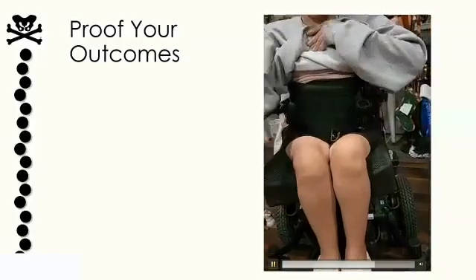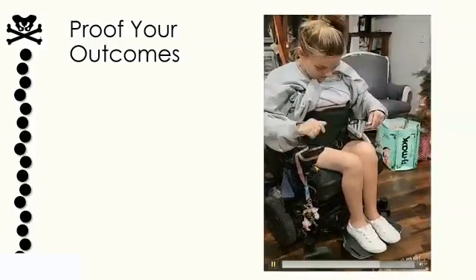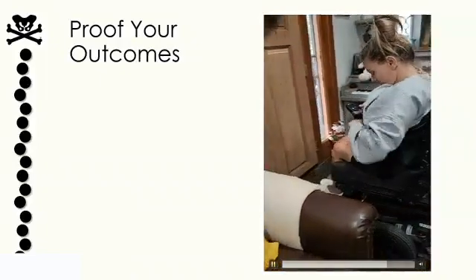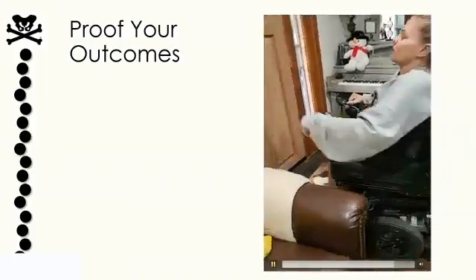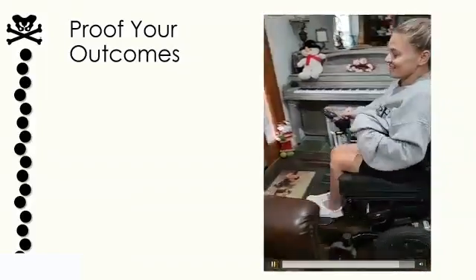And here real quick, she's going to do her drive. Can I drive? Can I reach everything? Can I turn all my corners? And that was a yes. She's also going to check some other gross motor tasks. Can I lean appropriately, get in and out? And then quickly she shows that if this is too tight and too restrictive, I cannot reach the door appropriately. And that is, blah, don't like it.